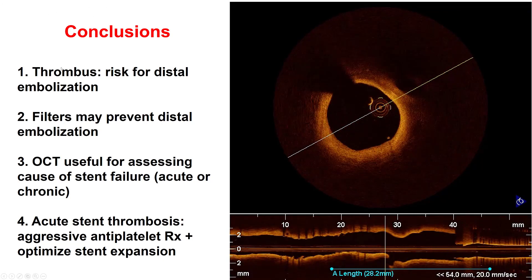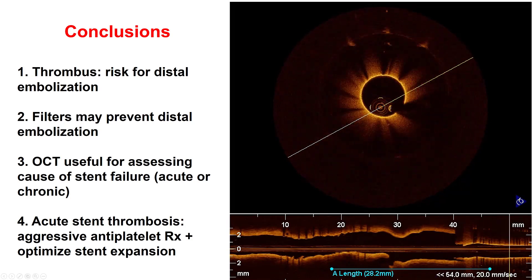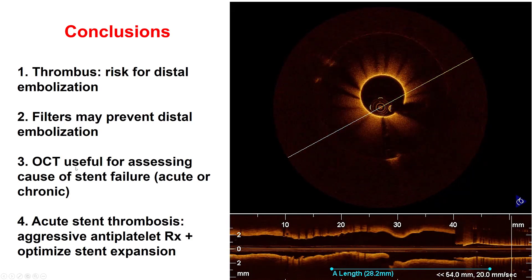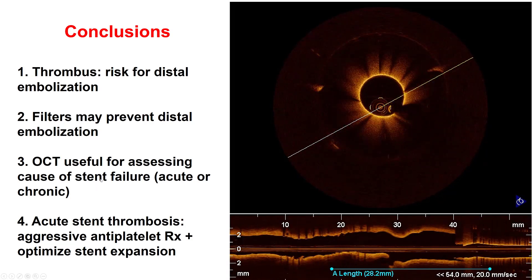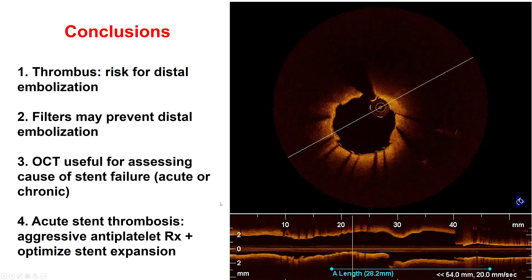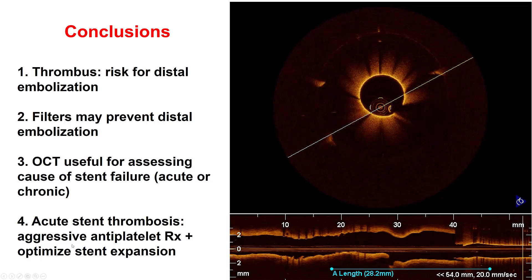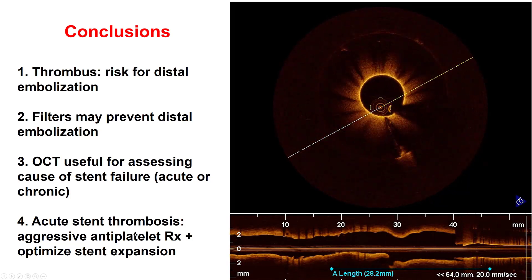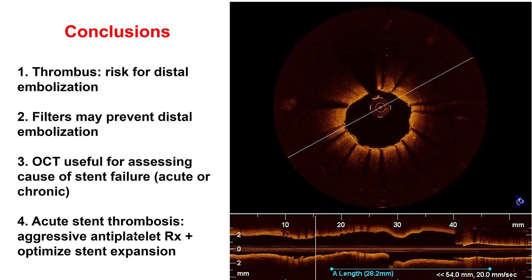Several lessons from this case. First, large thrombi can cause distal embolization and filters may be useful in preventing it. OCT is useful for assessing filling defects — it identified the thrombus initially and was also very useful for assessing stent failure, in this case demonstrating acute stent thrombosis. Finally, treatment for acute stent thrombosis includes aggressive antiplatelet therapy and optimization of stent expansion. Of note, the ACT was at therapeutic levels above 300 in this patient — sometimes stent thrombosis can happen due to suboptimal anticoagulation, but that was not the case here.